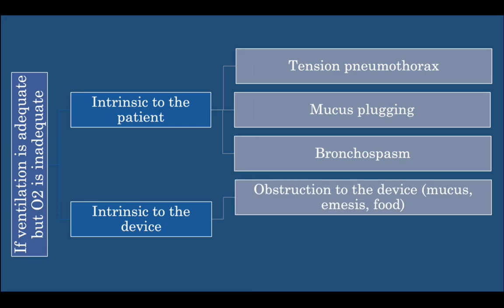And then lastly, think about your device. So is the device obstructed? Was there mucus in the airway? Is there emesis? Is there food?